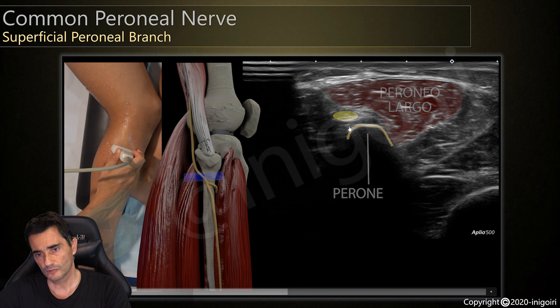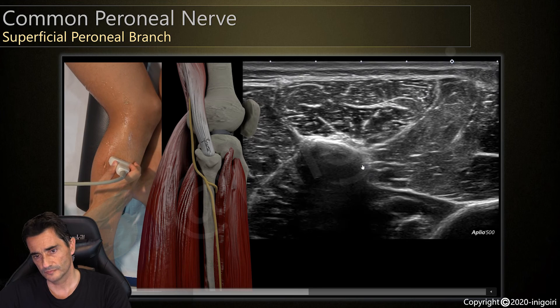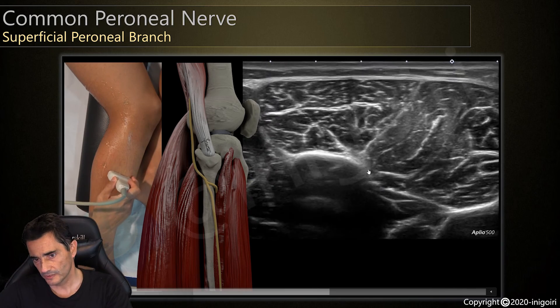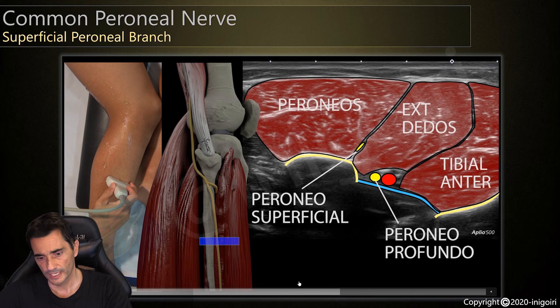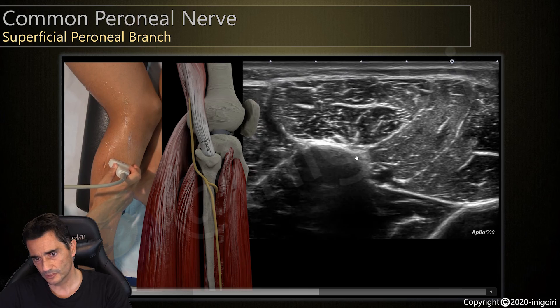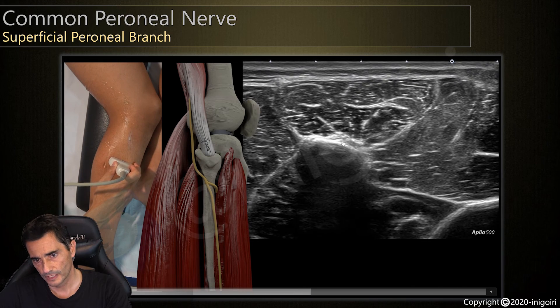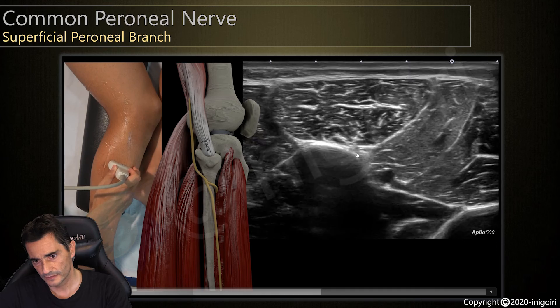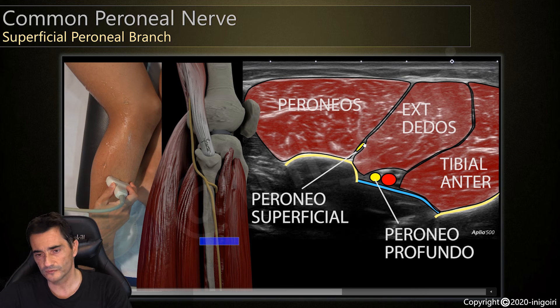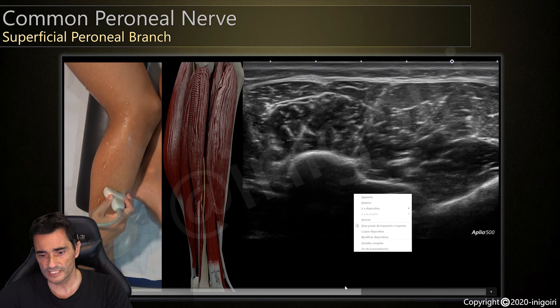Continuing to follow the common peroneal nerve — it is difficult to see at this level, so we use probe movements to better visualize it. Here we can identify the deep peroneal nerve and also the superficial peroneal nerve. The orientation of the nerve and its small size make visualization challenging, but you can see something moving here.